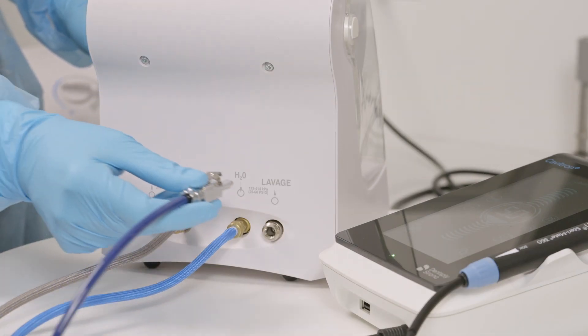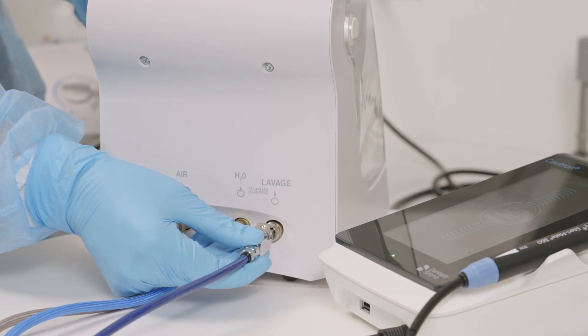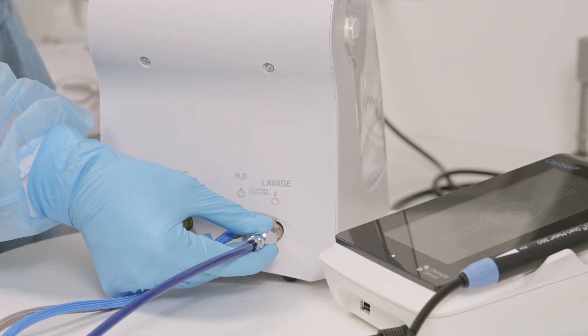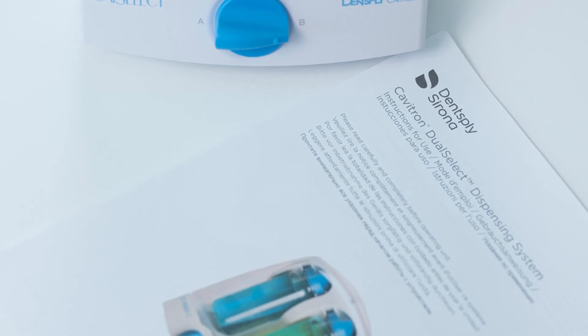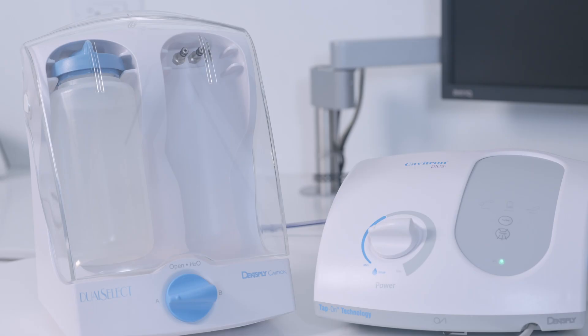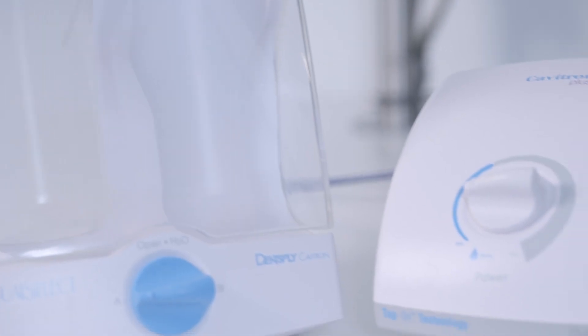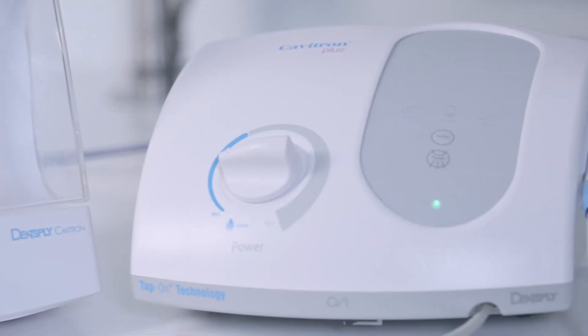Begin by connecting the Cavitron Scaling System to a Dual Select Dispensing System. Make sure to follow the weekly steps in the Dual Select System's Instructions for Use, or IFU. Once you've read the Dual Select Dispensing System's IFU and have properly connected it to your scaling unit, follow these steps.